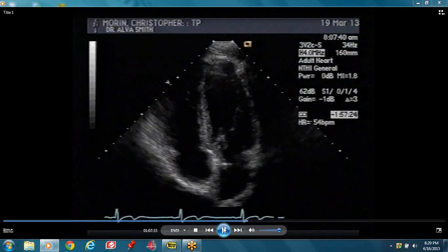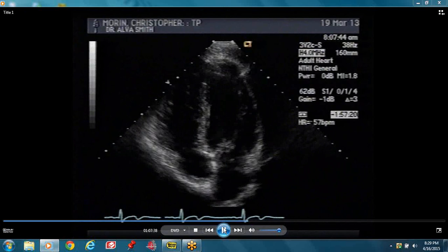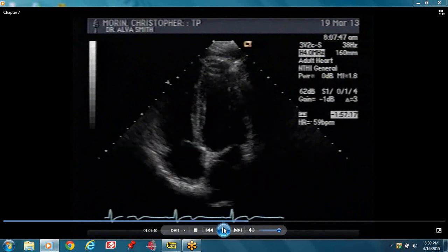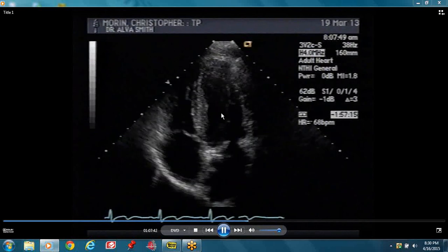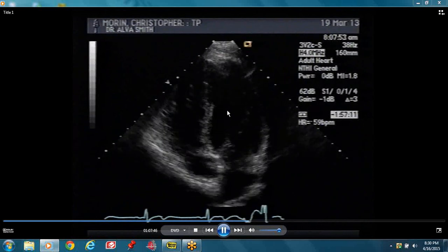Develop a strategy of naming. In systole the muscle thickens and in diastole it thins. When we talk about normal function of the heart muscle, it thickens in systole and thins in diastole. You can see that if you put a marker right here and play it — the heart moves towards this marker.